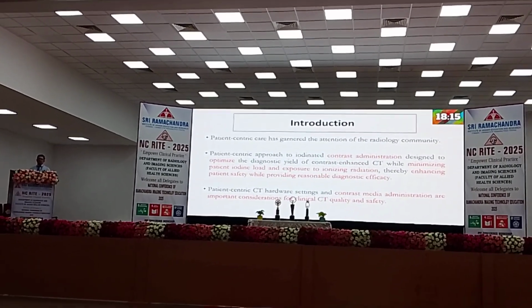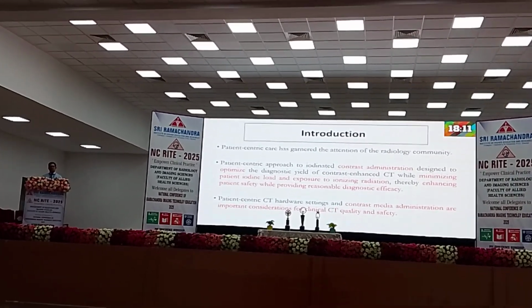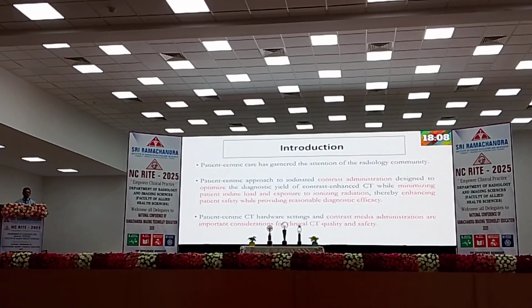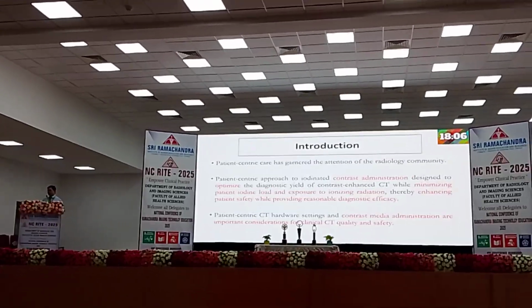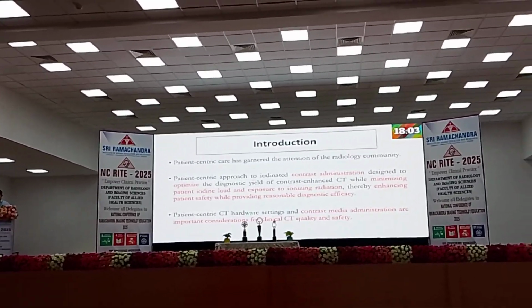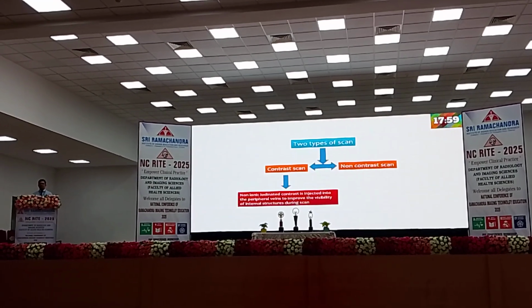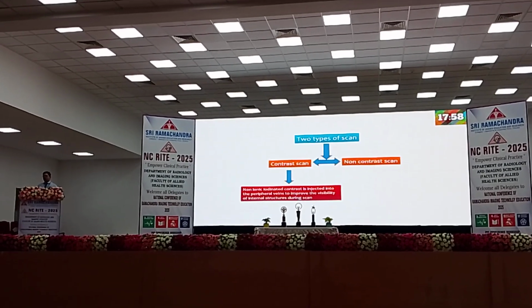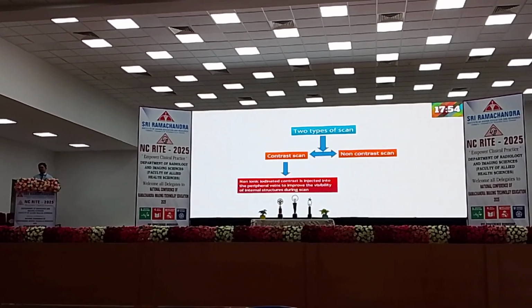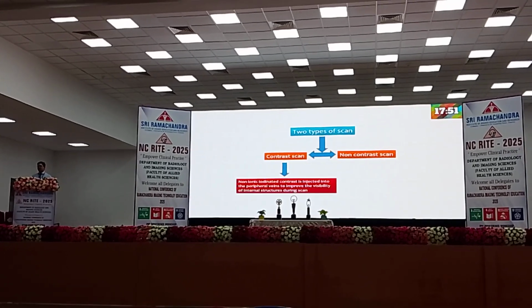Because I am very confident that whenever you are in posting, you are not going to hear much about the technical part. You just see that the senior-most technologist will be there, and he or she will say, you have to give 80 ml contrast to this patient, and then the person will say this patient is weighing 80 kilo, so 80 ml is enough. Give 3.5 ml per second, enough. So you just listen, but you don't understand the reason behind it.